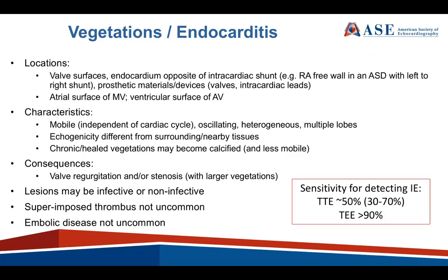And the sensitivity for detecting infective endocarditis by transthoracic echocardiogram is low. It's 50%, ranging from 30 to 70% in studies. And with TEE, this is why we do TEE, the sensitivity is much higher, greater than 90%.